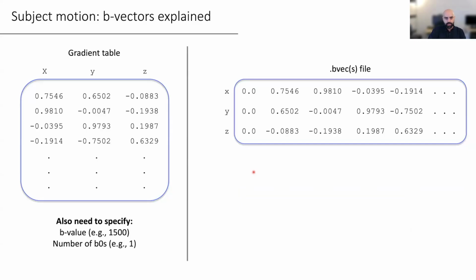So I'll start just with the bvec first. The bvec file is a file that has 3 lines and has as many columns as you have volumes in your acquisition. So again, in a typical diffusion acquisition where you have, say, 60 diffusion gradients and maybe 5 to 10 b0 images, what you have there is a file that will have 3 lines and maybe 65 or 70 columns.